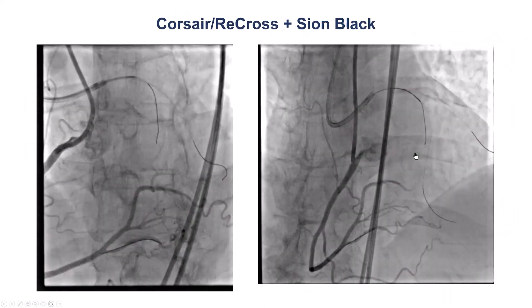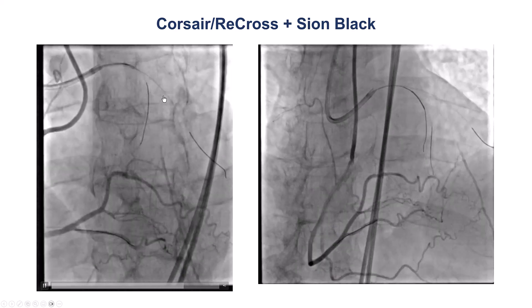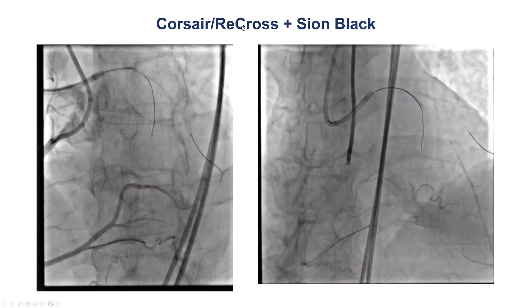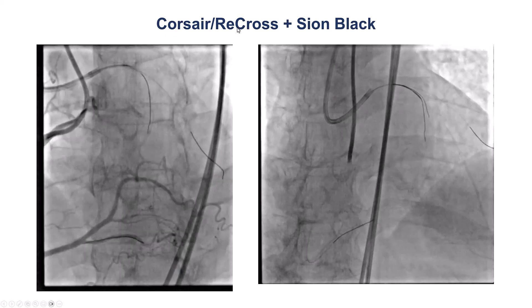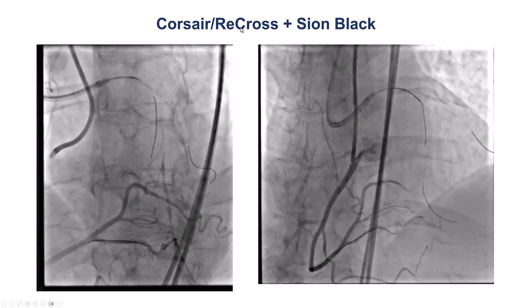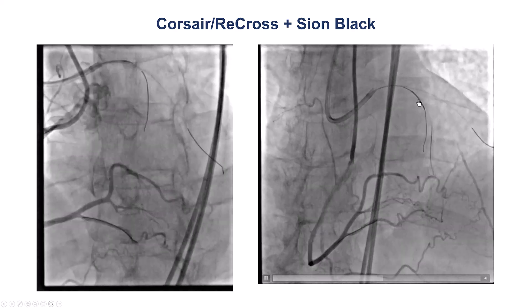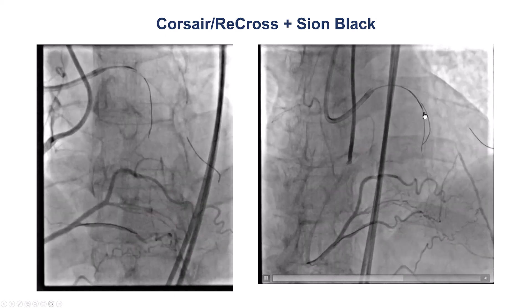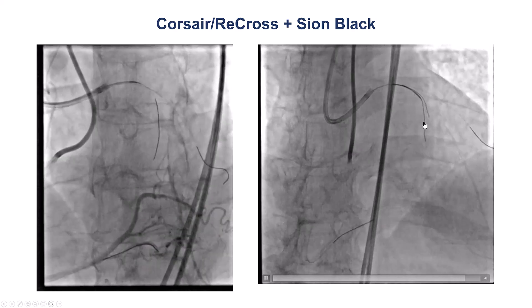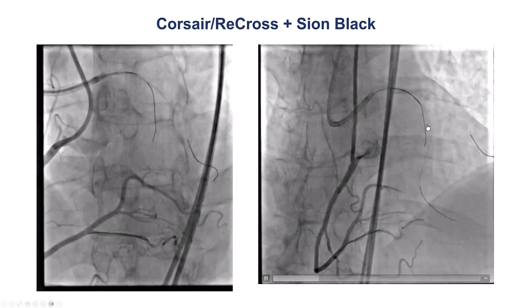We tried with a Corsair microcatheter, but the wire was going in a different plane. We then used a Recross, which is a dual-lumen microcatheter with two over-the-wire lumens. Unfortunately, despite trying to retract the guide wire, we were clearly not into the vessel — probably going into some septals proximal to the proximal cap.